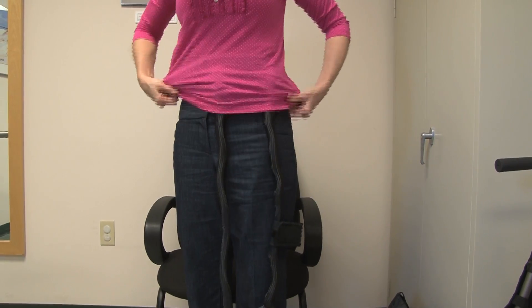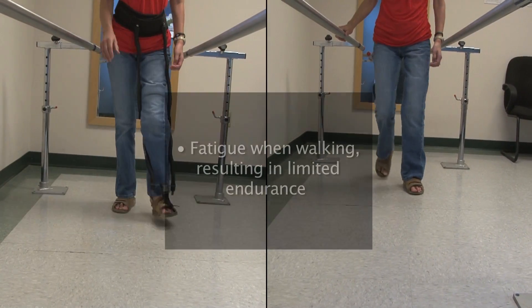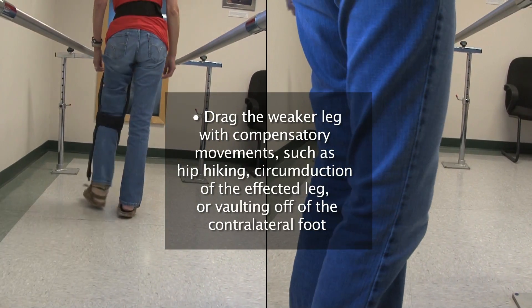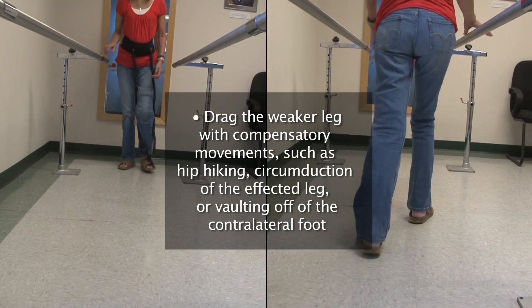The HFAD may be worn underneath or over clothing, and may be beneficial for individuals who fatigue when walking resulting in limited endurance, drag the weaker leg with compensatory movements such as hip hiking, circumduction of the affected leg, or vaulting off the contralateral foot.